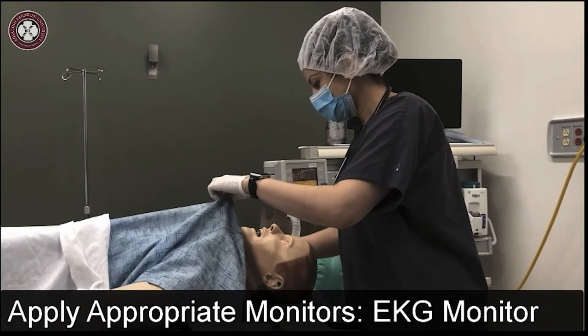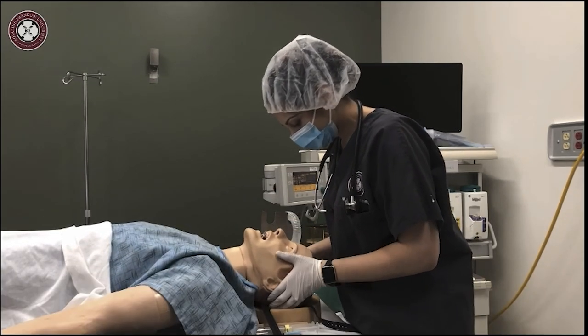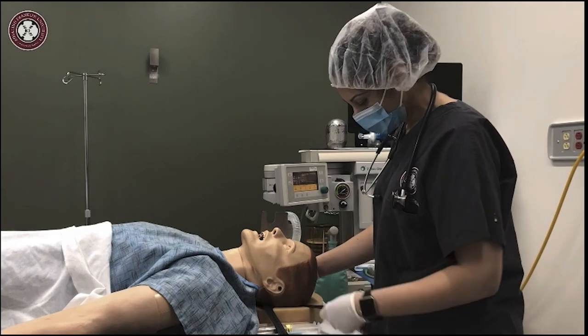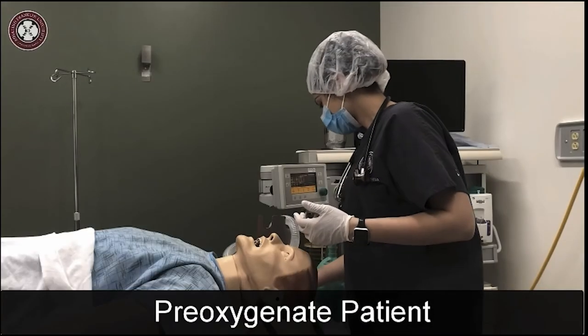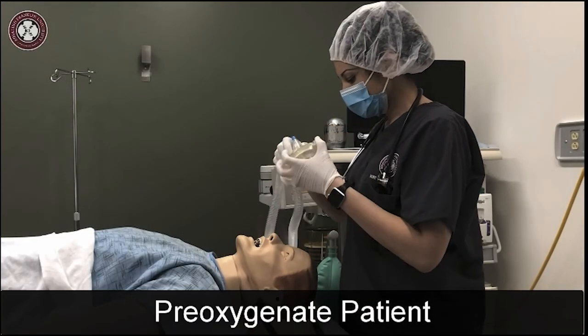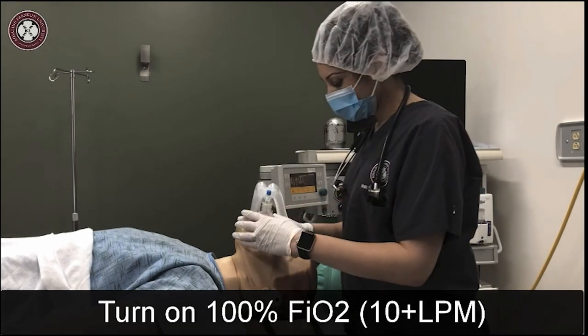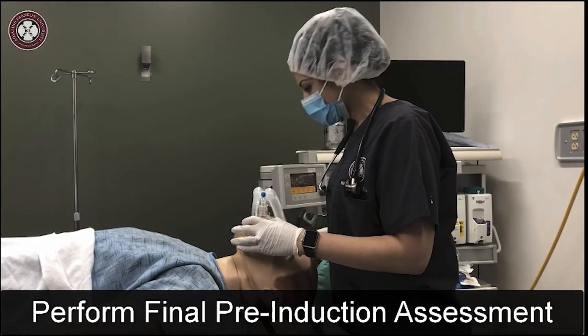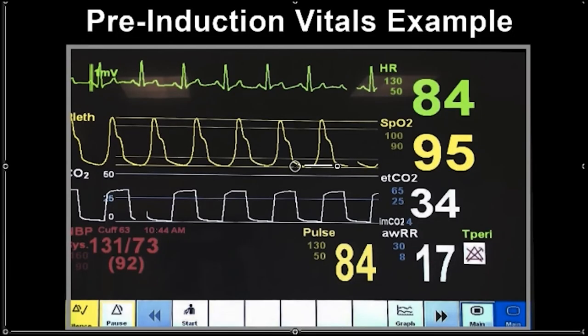If there are no limitations on neck mobility, place the patient into sniffing position by extending their head and flexing the neck. This position aligns the oral, pharyngeal, and laryngeal axes to optimize glottic access. Pre-oxygenate the patient by turning the FiO2 to 100% at 10 or more liters per minute for several minutes until the EtO2 is 90%. Perform a final pre-induction assessment of the patient and their vitals.